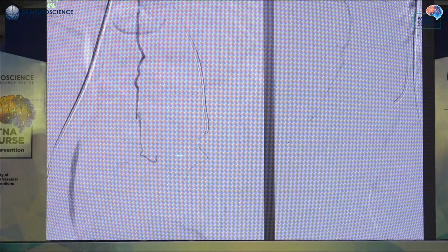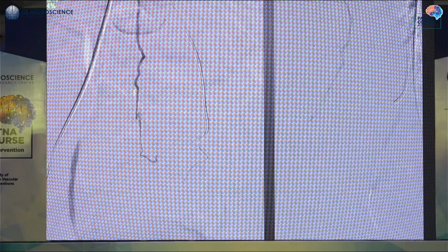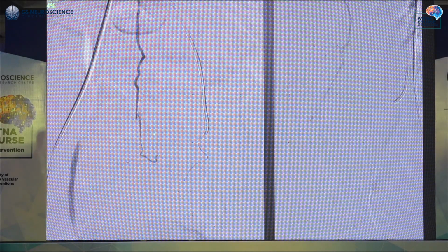This is the injection after that catheterization. You can see here, still this part of the artery remains. And there was a flow here. It was not a flow arrest. See, in this situation, there is one technique. If there is a stagnation of the contrast after you inject and stop, then this entire segment is plugged. As Rahul was saying, if it is completely plugged, then this segment of the vessel acts as an extension of your catheter. You can safely embolize and get your glue here.